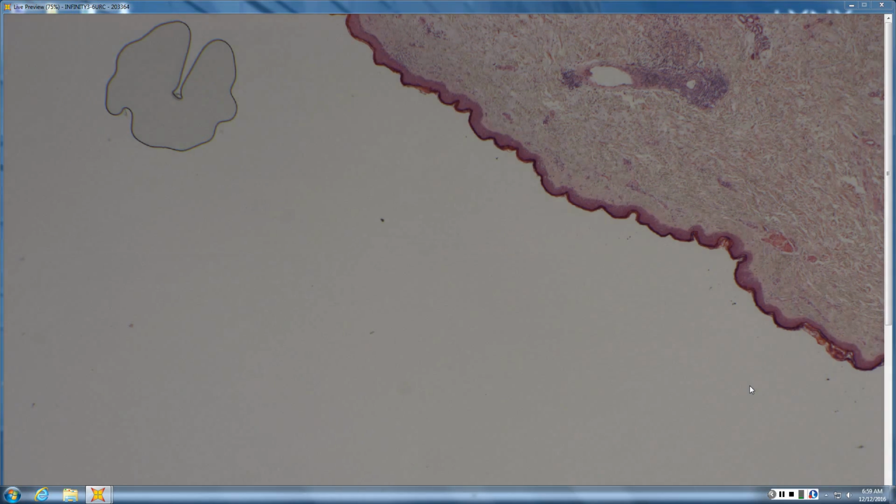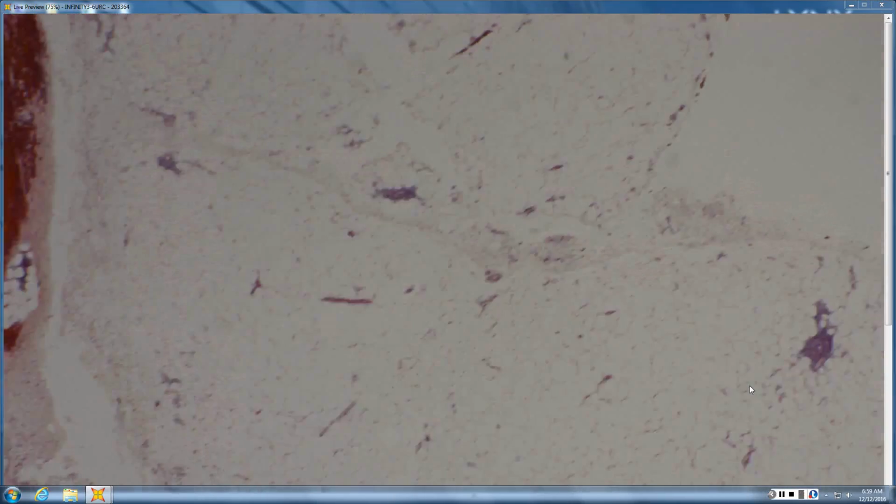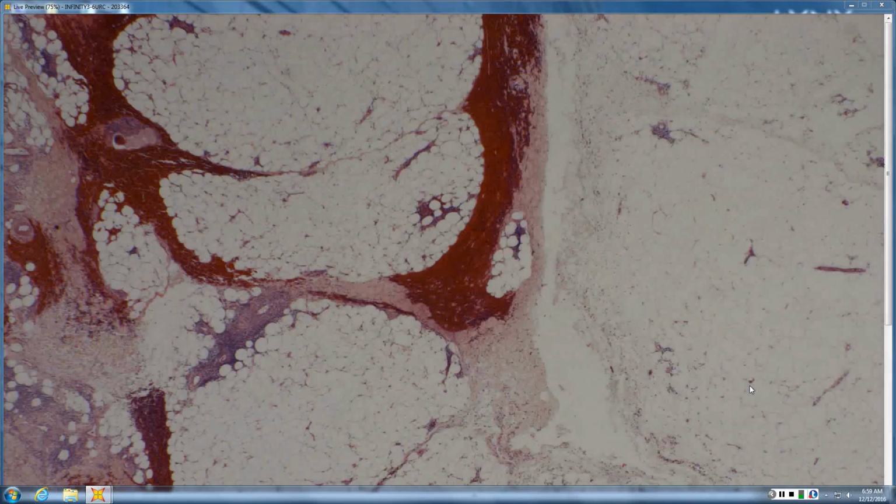So you're looking for the metachromatic staining of it. Everything looks really purple, and you're looking for that metachromasia in the stuff that you think is amyloid. What color will it stain then? I think of it as everything looks really purple, and then you get this pinky purple, kind of magenta purple.